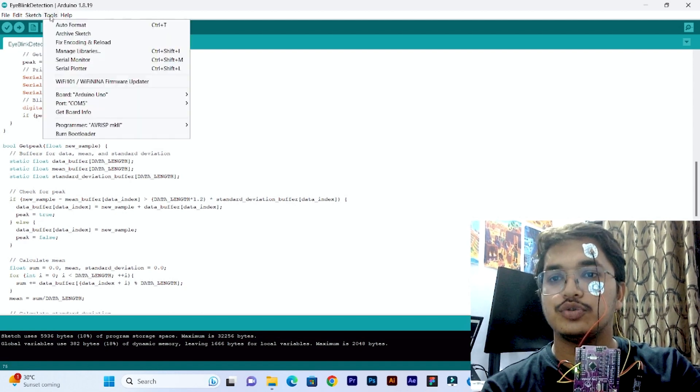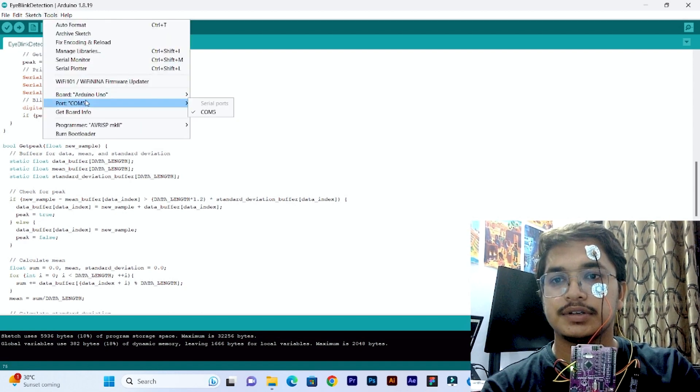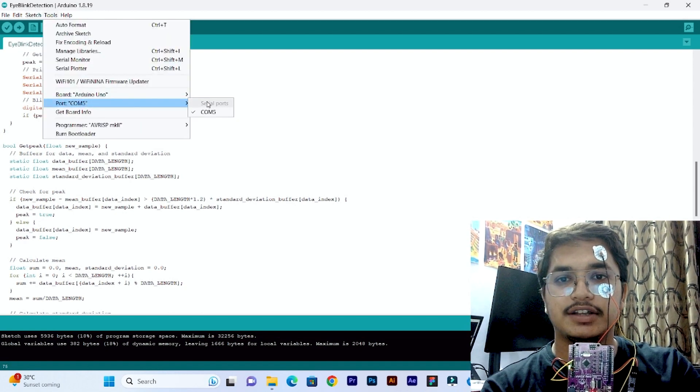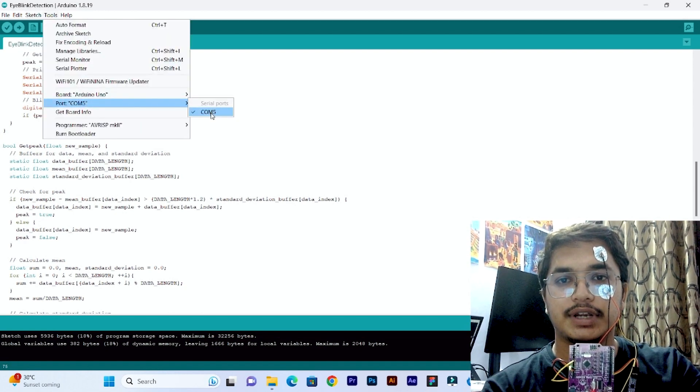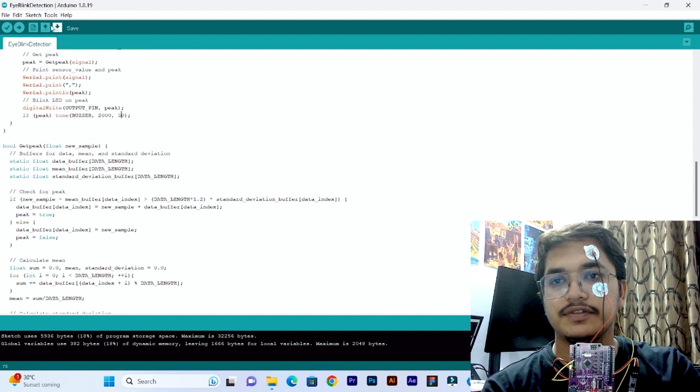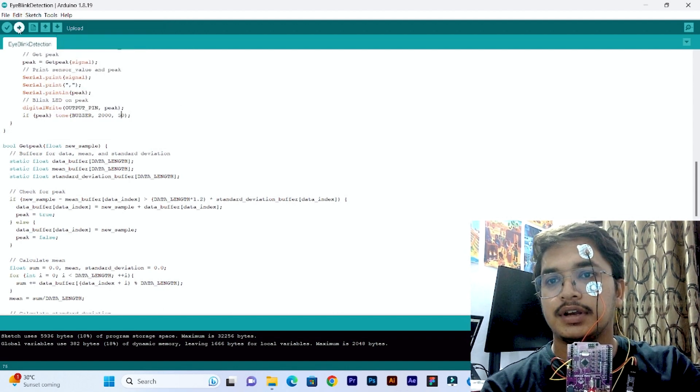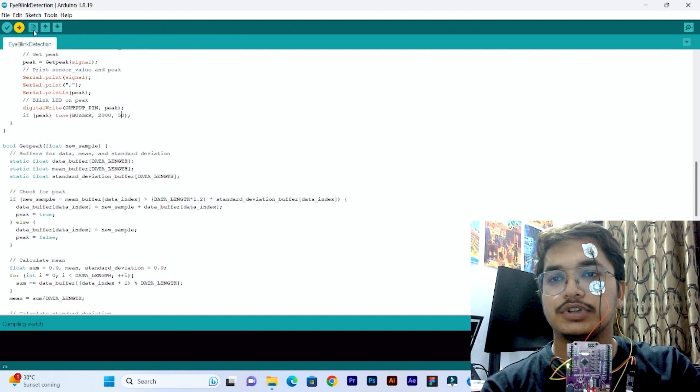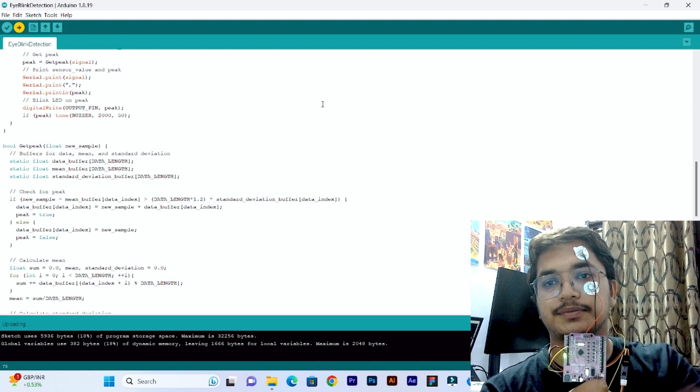Let's go to tools and set the COM port. In our case it is COM5. Now upload the code on Makeruno.